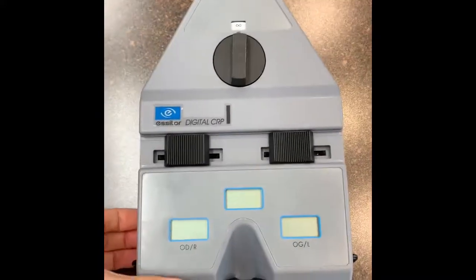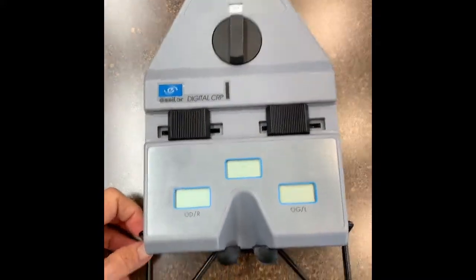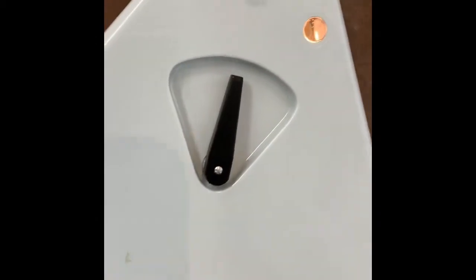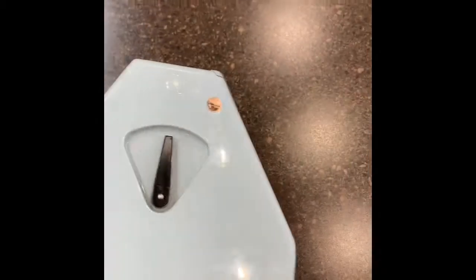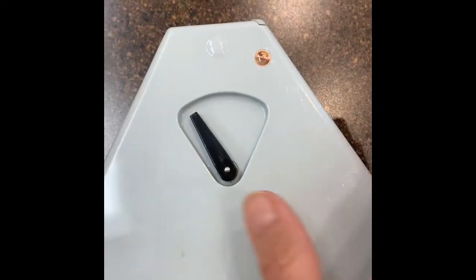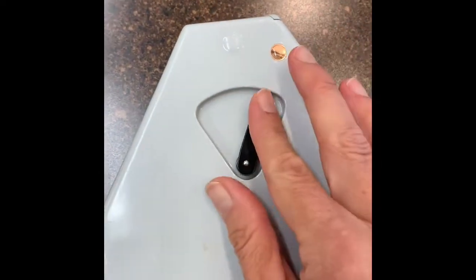Today we're going to train on how to use the Essilor Digital CRP Pupilometer. When this light comes on, it is turned on and ready to go. This controls whether you do right eye, left eye, or both.